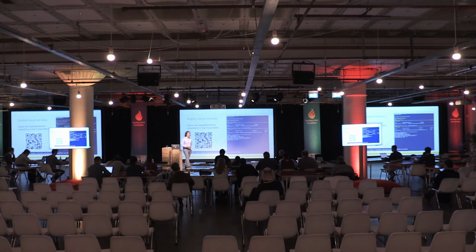Okay, so now we're on the step where we can actually clone the repository within your Azure Cloud Shell. So the repository is located at GitHub Microsoft/HealthKit on FHIR. So this is the actual HealthKit on FHIR project. There's a sample app in there, and there's also a deployment script that allows you to set up a cloud environment for the sample app. So I'll give you a chance to go ahead and clone that.